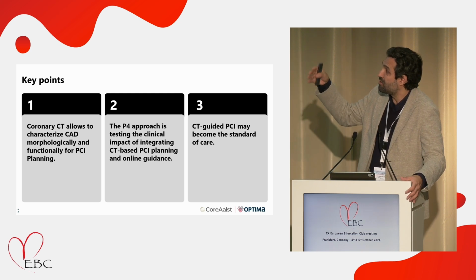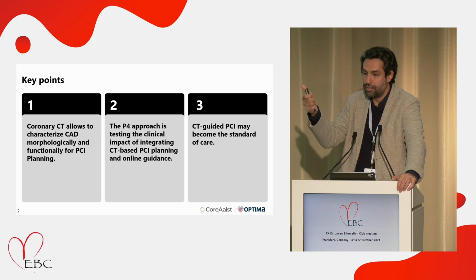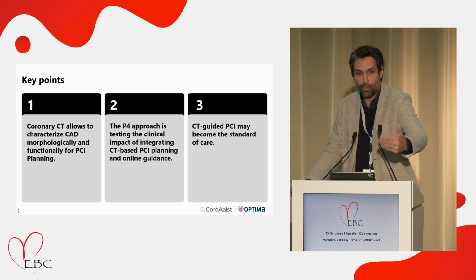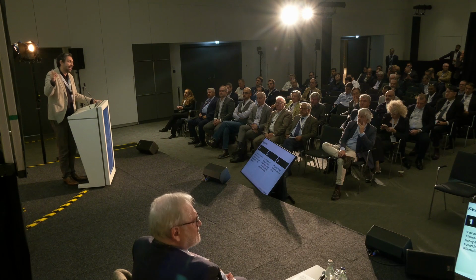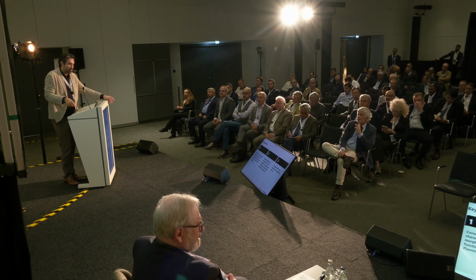I think the P4 approach is basically testing two elements. The first element is the planning element, which is extremely important: going in the cath lab, exactly knowing what to do. And second, the online guidance. Having that plaque reconstruction in front of you all the time really makes a difference.